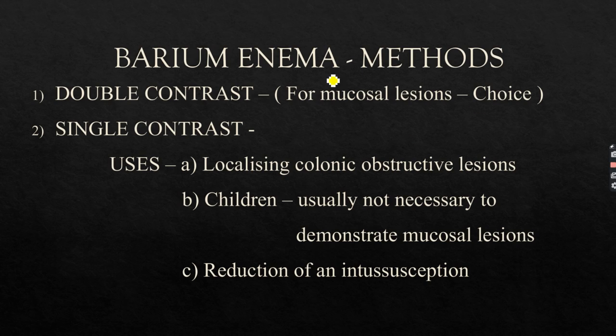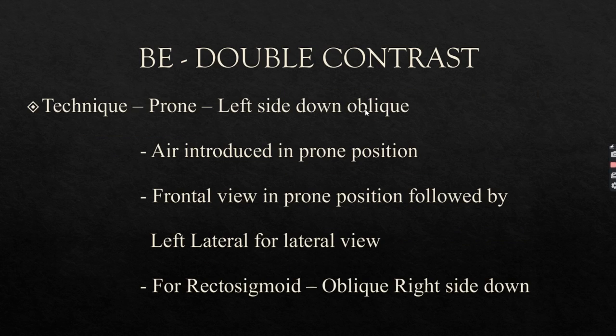And if you want to look for mucosal lesions, the choice is double contrast barium enema. Lesions where? Lesions in the large intestine. Barium enema means large intestine. Okay. Double contrast.